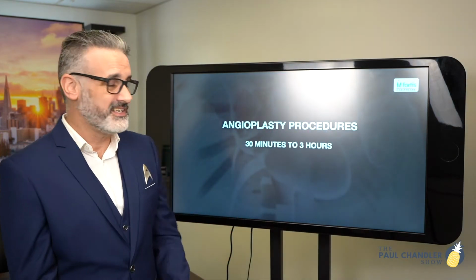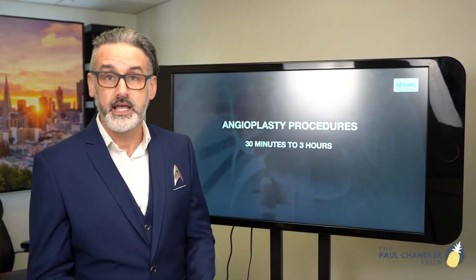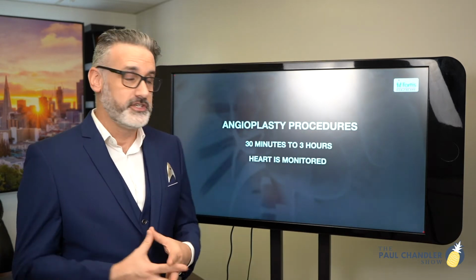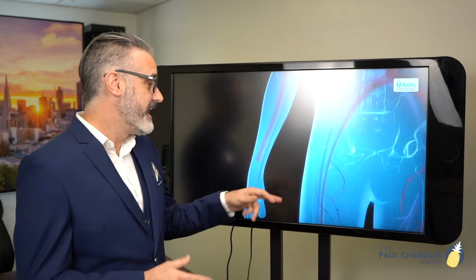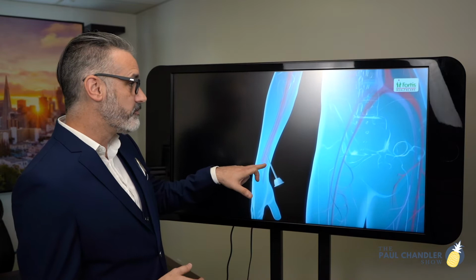The procedure itself takes between about 30 minutes to 3 hours, depending on how many blood vessels they have to do. And the heart is monitored, and before the procedure actually begins, the patient is getting an intravenous or an IV sedative. So first, the needle will be placed.